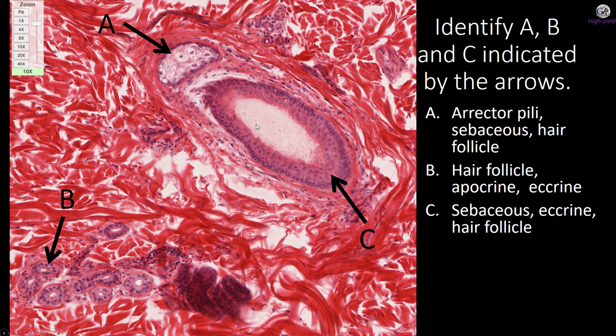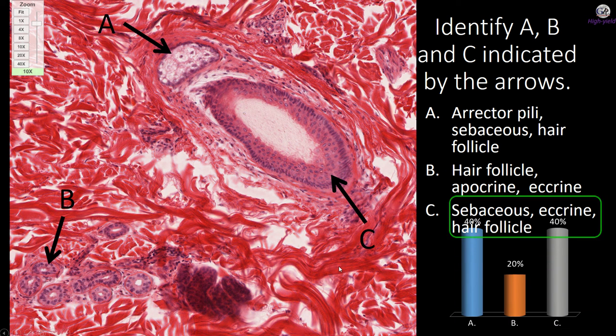Definitely looks different than the eccrine. And this is going to look like part of the epidermis. Maybe it's a hair follicle. So the hair is just falling out. It's obliquely cut. It looks like this is mainly showing you the glassy membrane here, external root sheath, internal root sheath here, and then you kind of lose the hair. So that's what I'm looking at, hair follicle here. So I'm going to go with A is sebaceous gland, this one. B is eccrine and hair follicle. I'm going to go with C for this one.